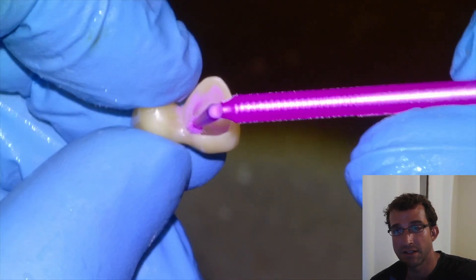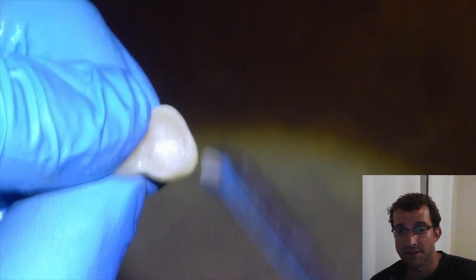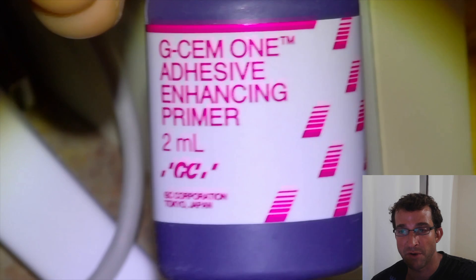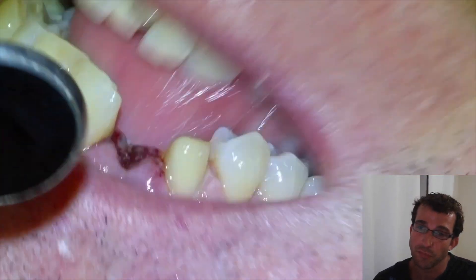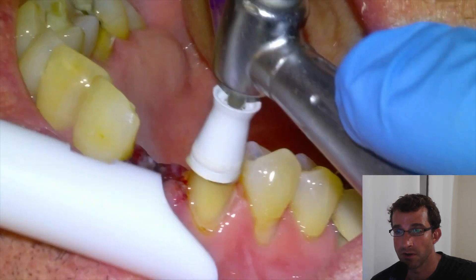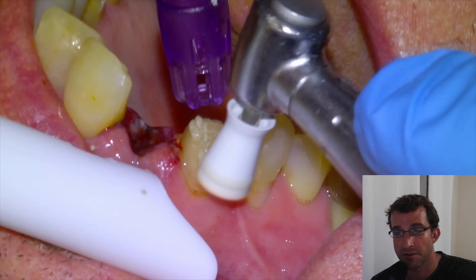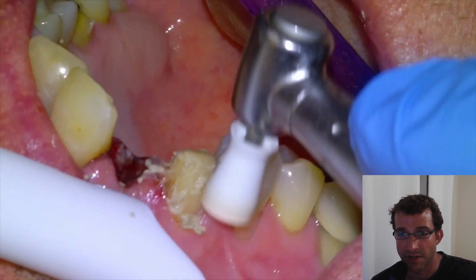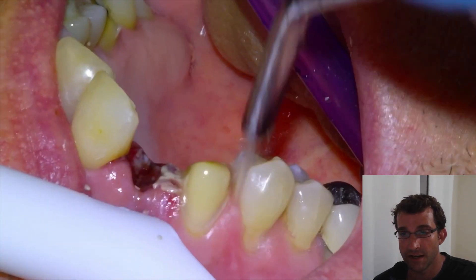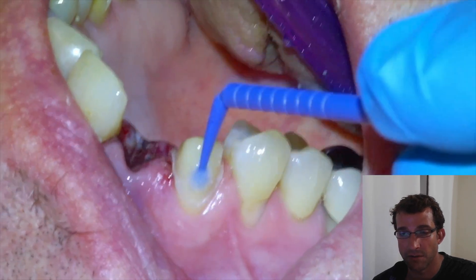We'll probably give a little bit of relief for the bite as well. Then we'll take the unit out, rinse and dry, apply some IvoClean, rinse and dry again, apply some ceramic primer — which is optional — but since the 1-2 pontic is going to be putting a little more stress on the tooth, we figured we'd do all the extra optional bonding steps. Generally for single unit crowns I won't use a ceramic or tooth primer, but we're using both in this case. We'll pumice the canine tooth and give it a little prime with tooth primer as well.